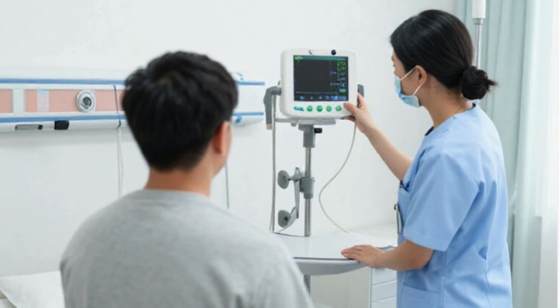Electrical safety is a major concern in patient monitoring systems because the devices are connected directly to patients for extended periods. These systems are designed with isolation circuits and low leakage current to minimize the risk of electric shock. Routine safety testing is required to verify that the monitor meets safety standards.